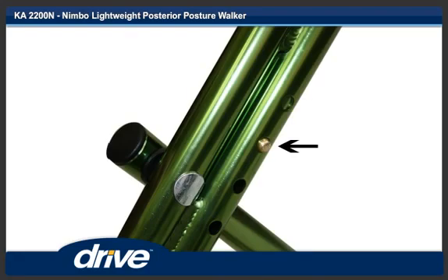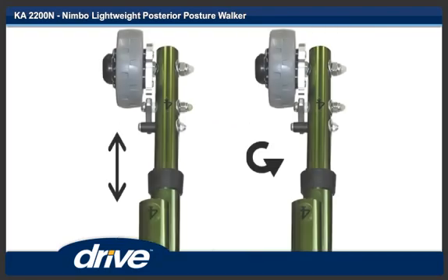Step 8. To adjust the height of the leg, push in the locking button and twist the leg slightly. Step 9. Set the leg to the desired height and twist the leg back until the locking pin engages. Repeat steps 8 and 9 for the remaining legs.